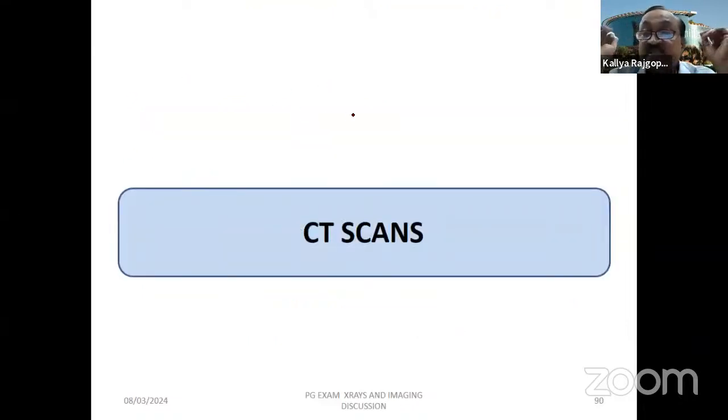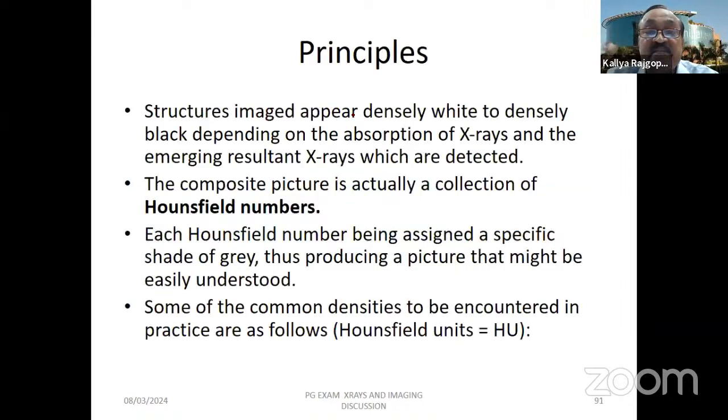So we have done with the basic ultrasound and mammogram. As I mentioned to you, the more films you see, the more idea you will get, and you'll be able to read. Now we'll go to some basic CT scan.